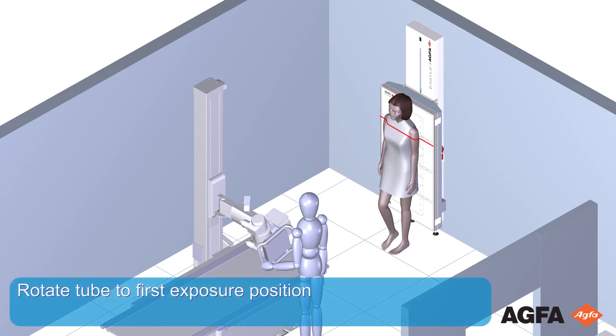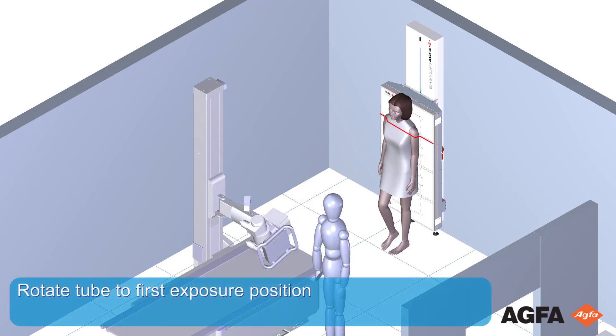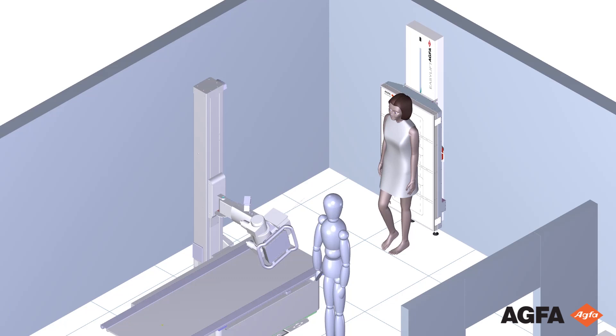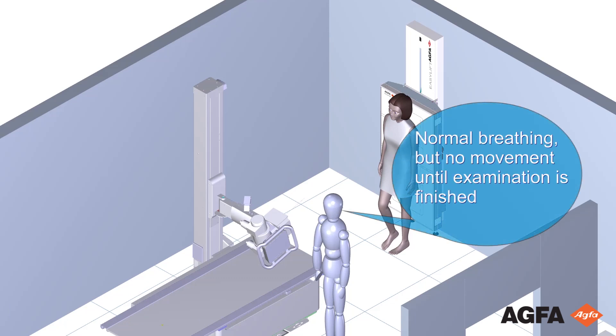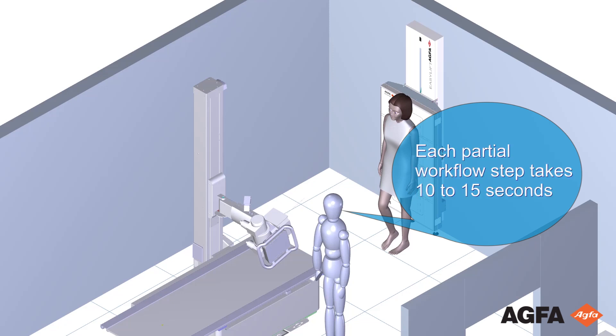Rotate the tube to the first exposure position, indicated by a center line. Inform the patient about the number of exposures: normal breathing is allowed, but no movement until the last exposure is finished. Each partial workflow step takes about 10 to 15 seconds.